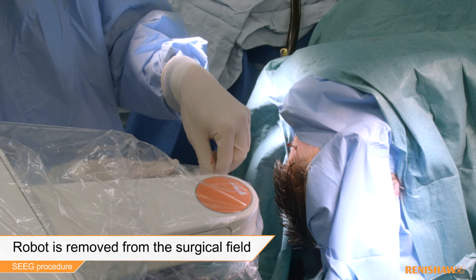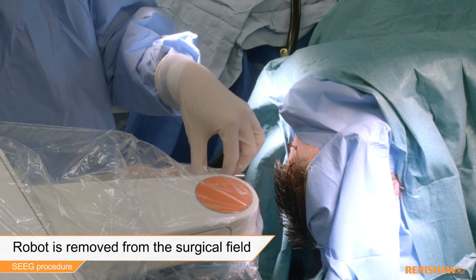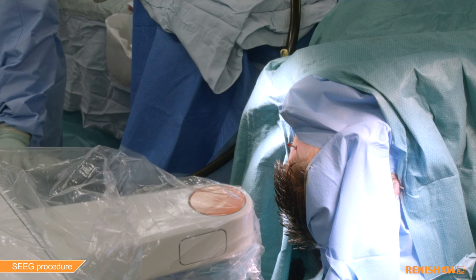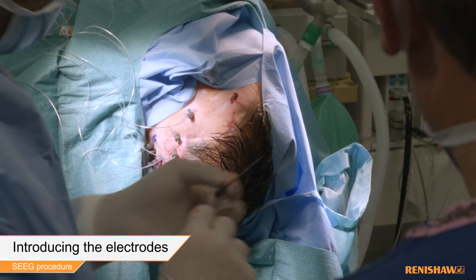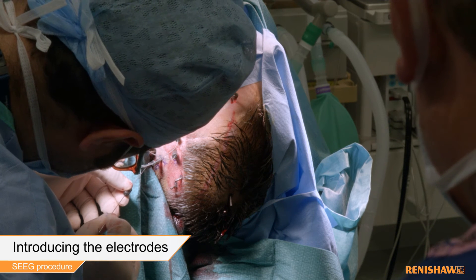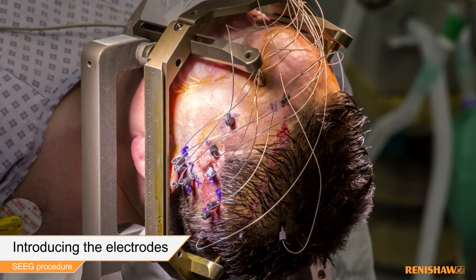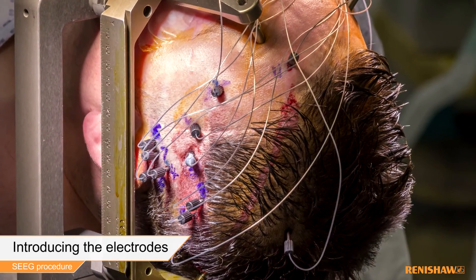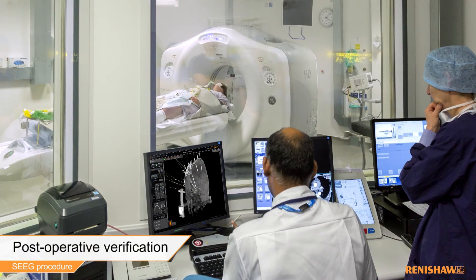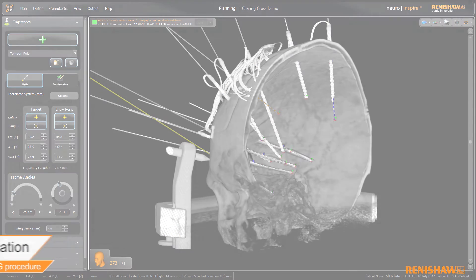The Neuromate robot is now removed from the surgical field. Into each guide a stylet of known length is inserted to create a track for the introduction of the appropriate electrode until all electrodes are in place. At the end of the procedure a post-operative CT verification scan can be performed to ensure that each of the electrodes has been successfully delivered to its planned trajectory.